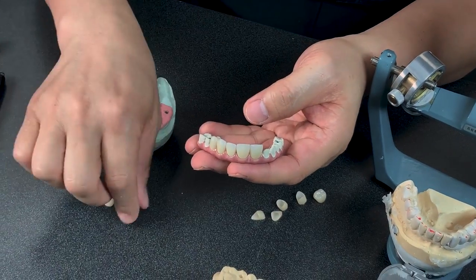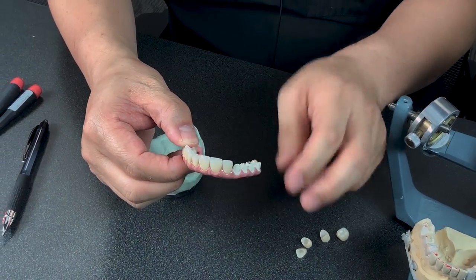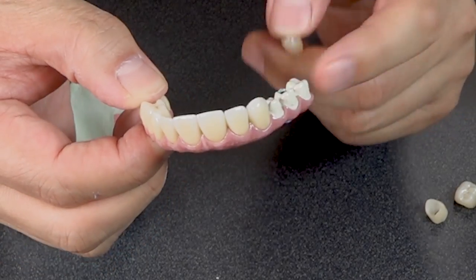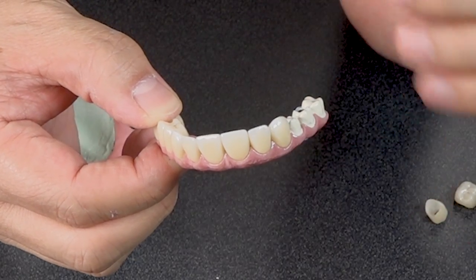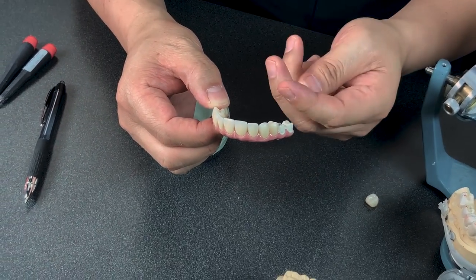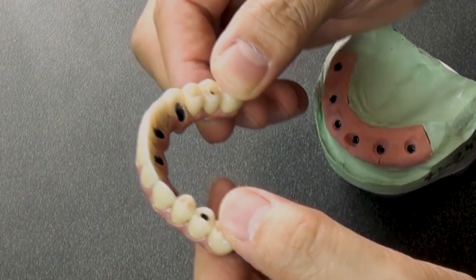4, 5, 6, 7 — see? We'll cement it. We have to watch out the cementation color. This is a B3 base color, and we put it in the opaque. So we're going to use A1 that will match it — otherwise you will get this coloration. Watch out when you do clear. I want to go to a little lighter opaque color.